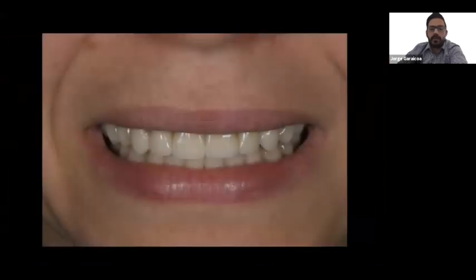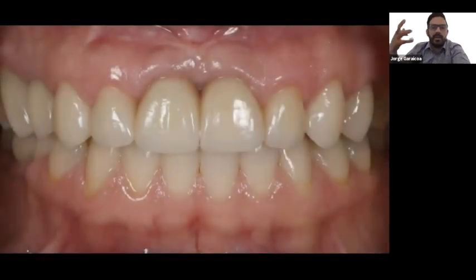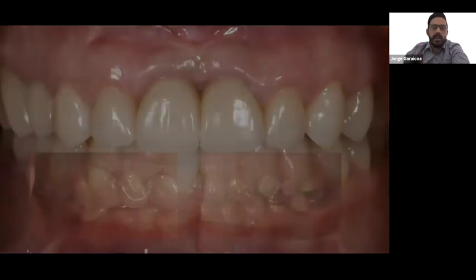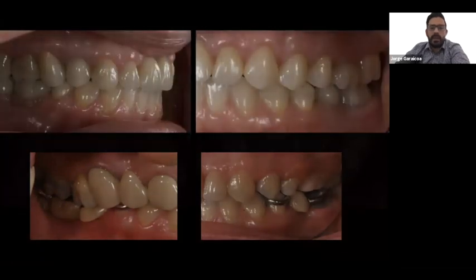So we went from this to this right here, the patient's smiling picture. We can see that we provided the patient with full contour monolithic lithium silicate restorations with just a little bit of micro layer on the incisal. We don't really need a lot of translucency in her case. She's a middle-aged woman. We are more concerned with having this balance of soft tissue and restoration, making sure she understands how to clean her prosthesis, and that we will have this for a very long time.